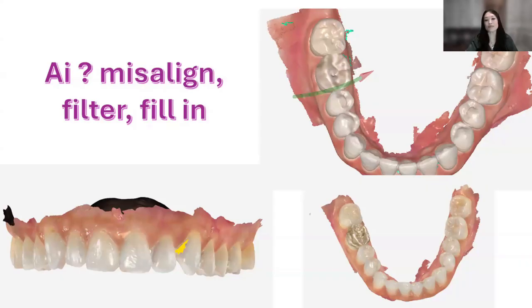All right, so let's look at the top. Oh, what the heck are all these arrows? That's our AI talking to us again. It is. So the AI arrows indicate that the software recognized that maybe there's a little bit of a gap or a seam, right? And then what it wants you to do is pick up your scan and follow it. Go from the buccal, roll over to the lingual to be certain that we have a clean scan there. That's the AI.